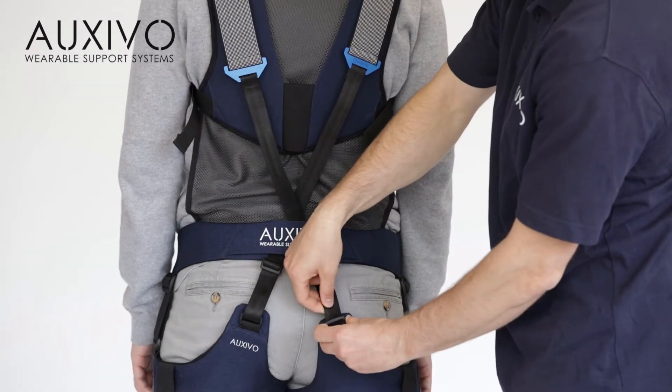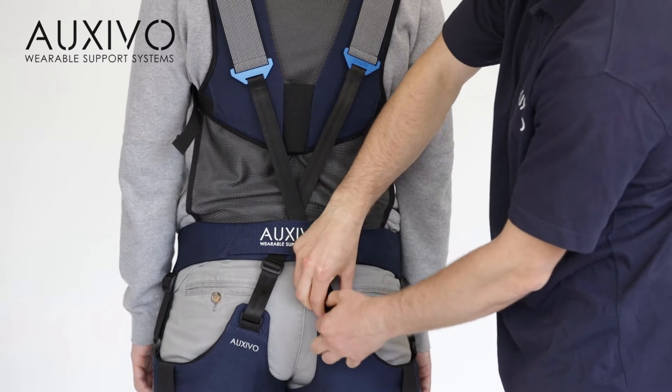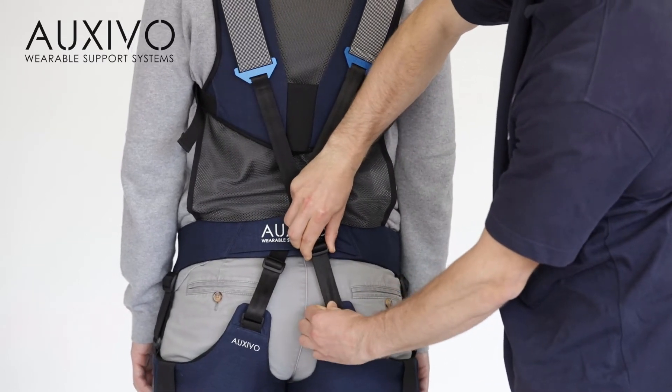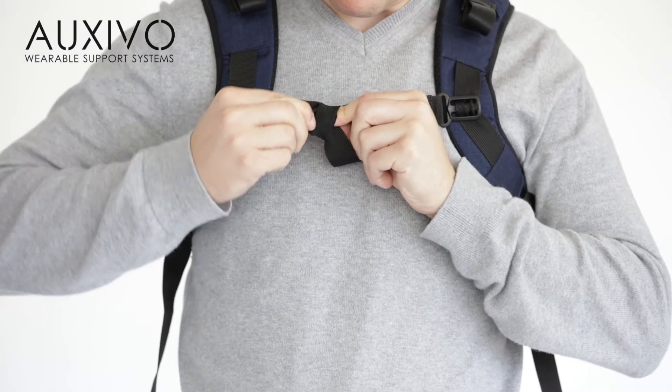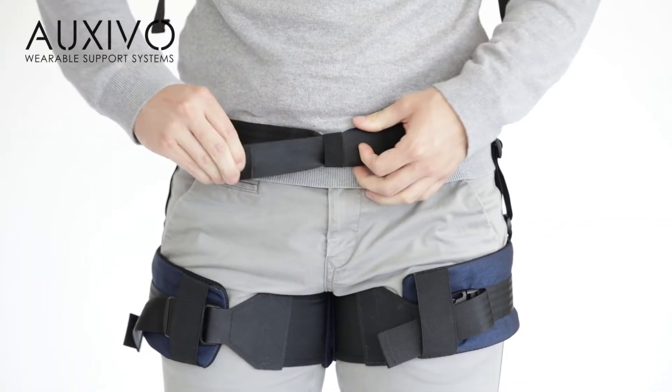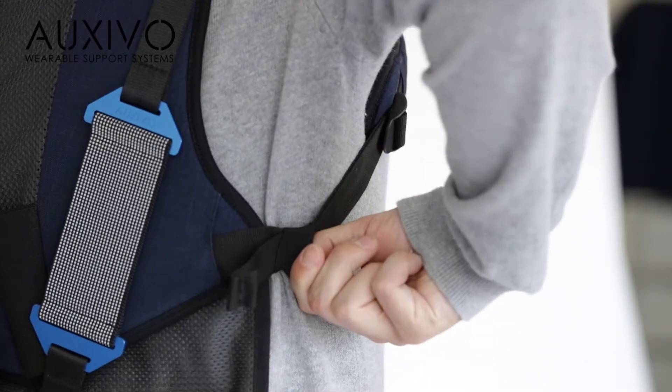The elastic elements on your back that store the energy should be located on the vest. To adjust the lift suit to your body height, move the adjustment buckles on your lower back. Loose band ends are potentially dangerous as they could get stuck. To avoid this, there are loops installed to safely secure all loose ends.